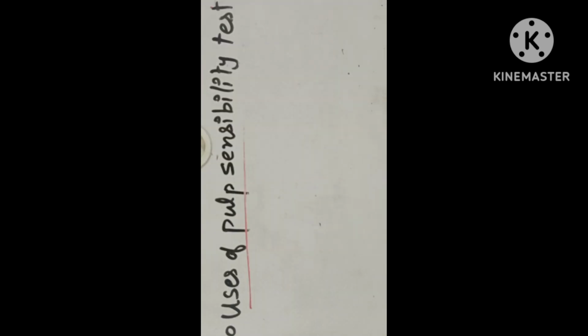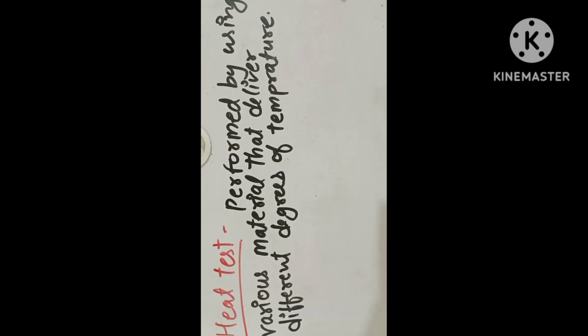The findings from the pulp test should be correlated with the case history and clinical findings to arrive at a proper diagnosis. So now we can see the heat test, cold test and electric pulp test. First was the heat test.